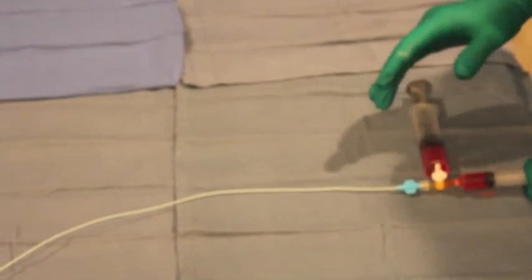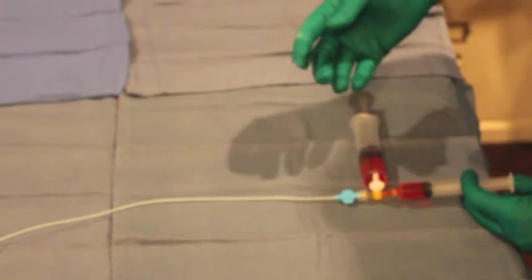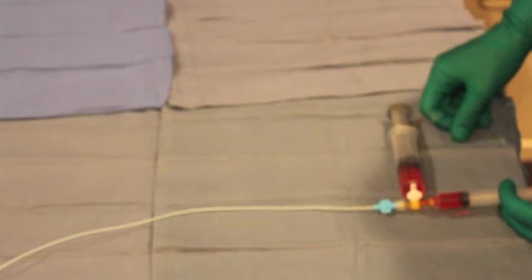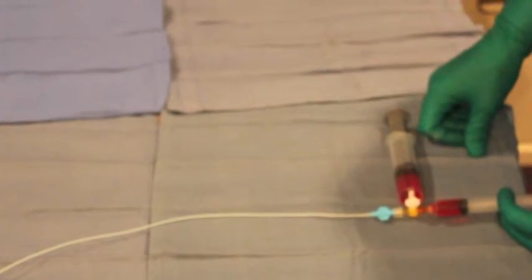And you wait, you do it again, reassess, because with the closure of smaller vessels, other ones will open up, and then you can advance and get more beads into the area of interest. Also with the dilution, there's less premature occlusion.